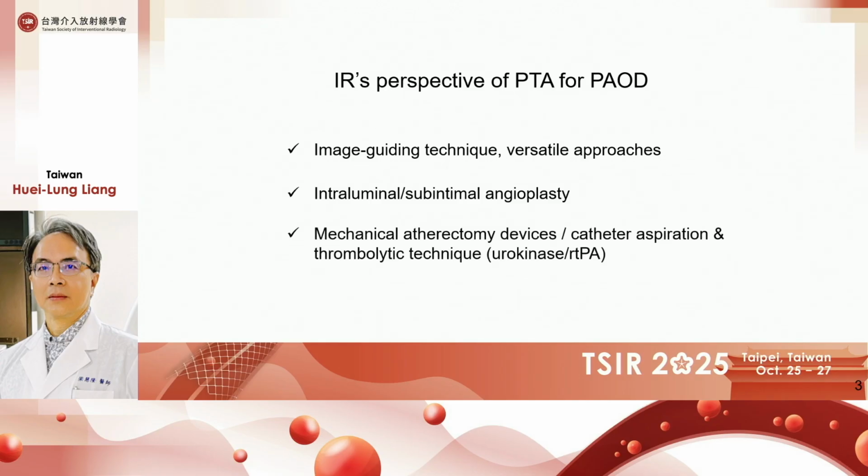We removed thrombus not limiting to mechanical atherectomy devices, but also by catheter aspiration and urokinase thrombolysis. This thrombolytic technique is very important to help us resolve many clinical scenarios.